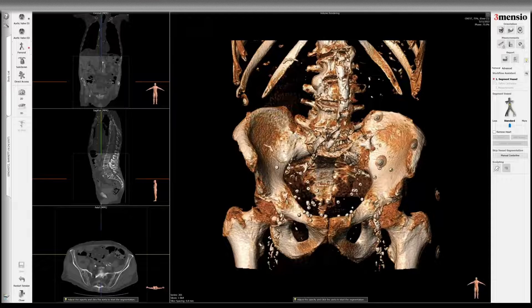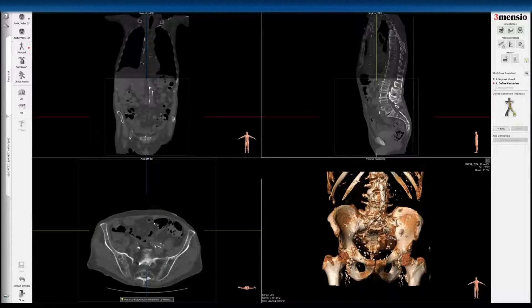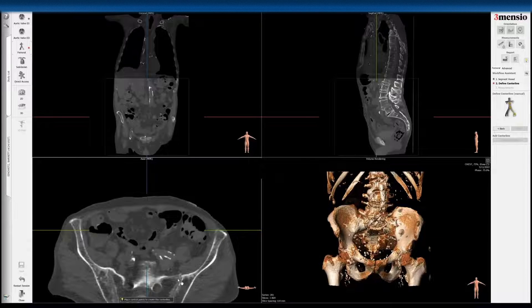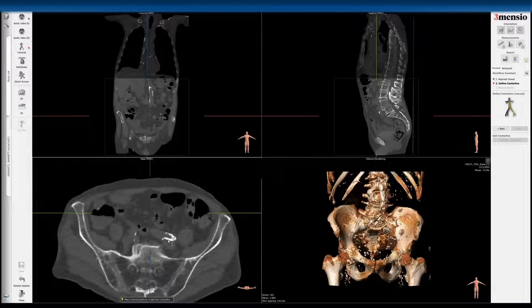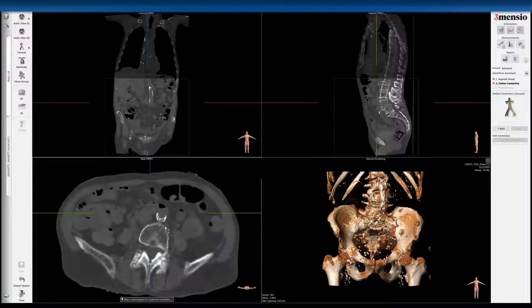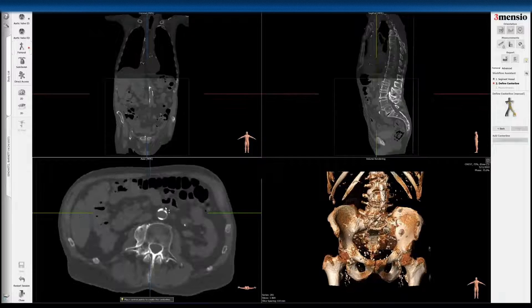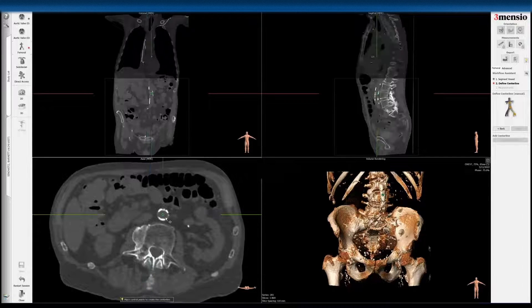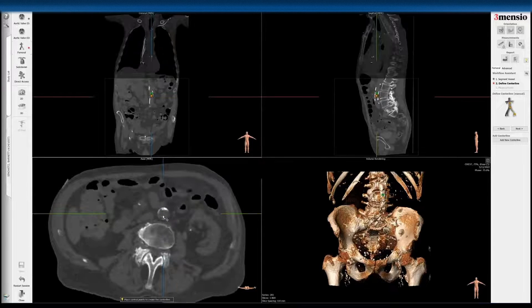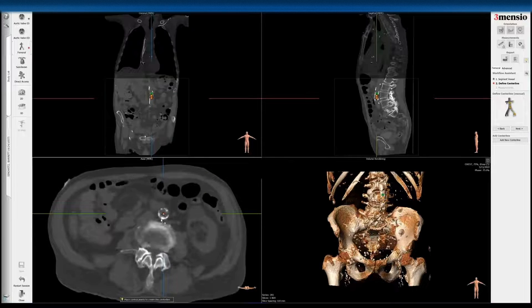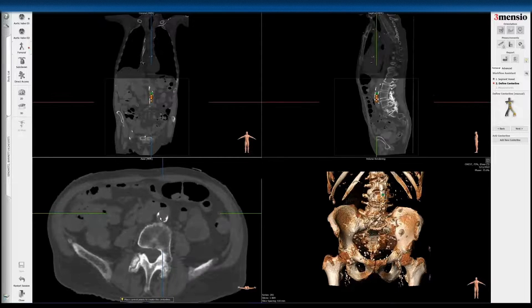You can see this is the layout in the femoral tab. And rather than doing automatic segmentation — because there's no contrast — you're going to have to go here on the right side on manual centerline. So once you're in there, you want to go into the abdominal aorta and see that it is quite calcified. You start with the centerline dot to trace out the center aorta going to the right iliac artery.